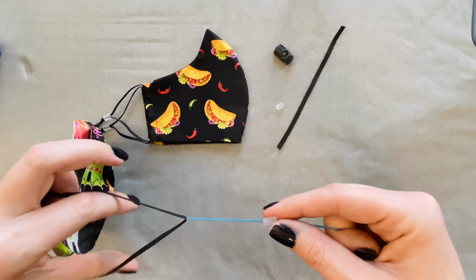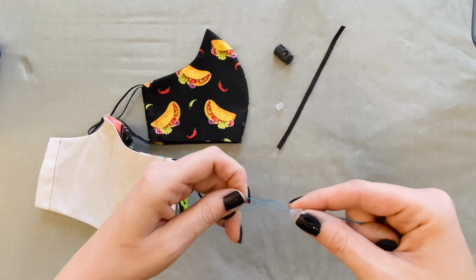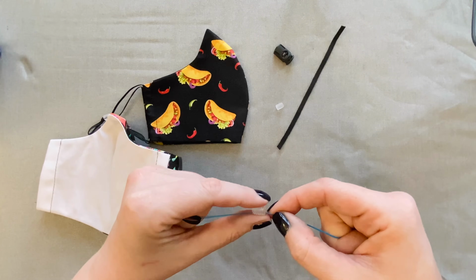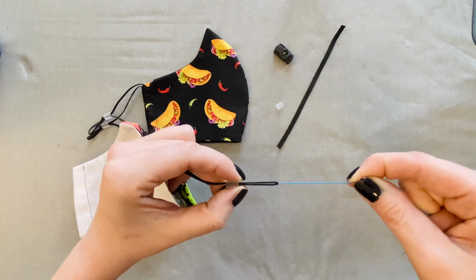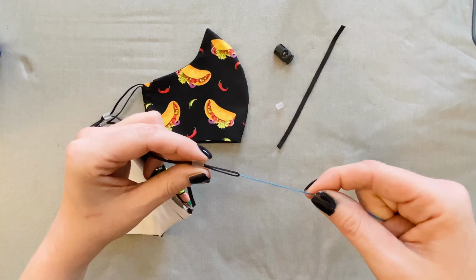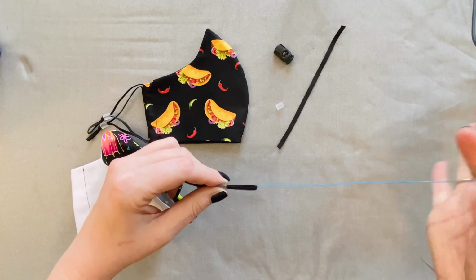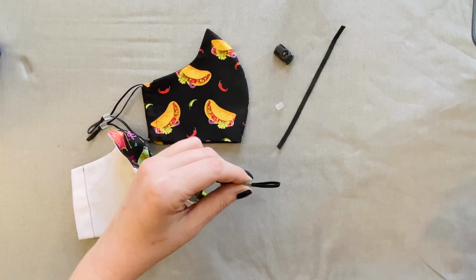There we go. So I've got my elastic here, I've got my thread looped, and I've got my adjuster here. So I'm going to hold my adjuster with my fingers. I'm going to pull, and see, it'll pull it through for you. If you try to shove that elastic through on your own, it's going to be a giant pain. So this just makes it a whole heck of a lot quicker. And then I can be done with my needle.